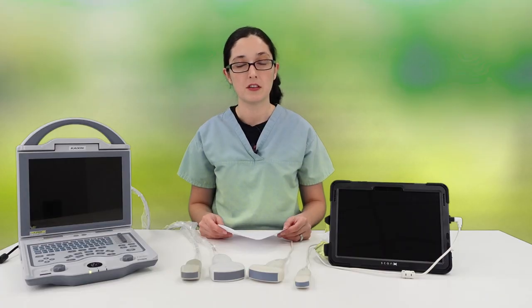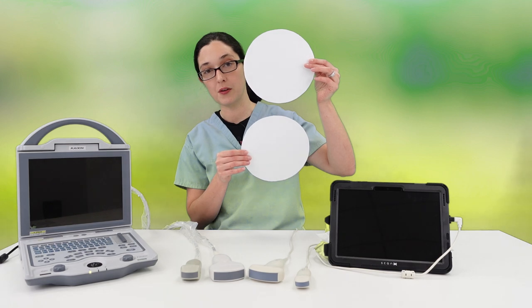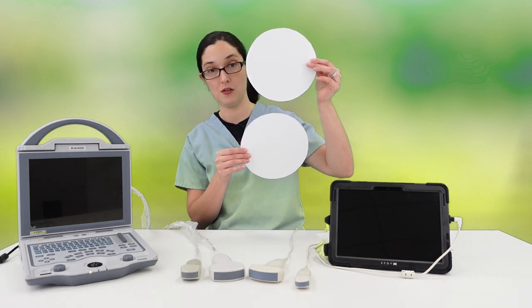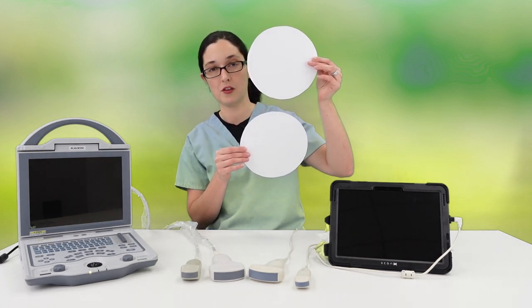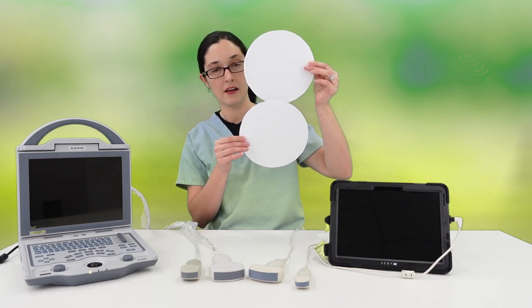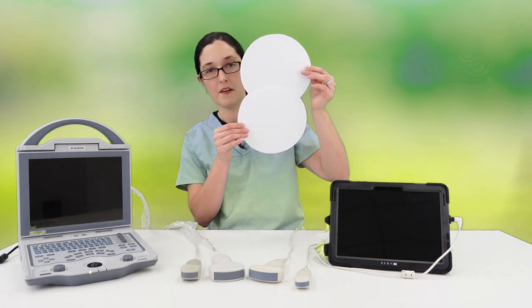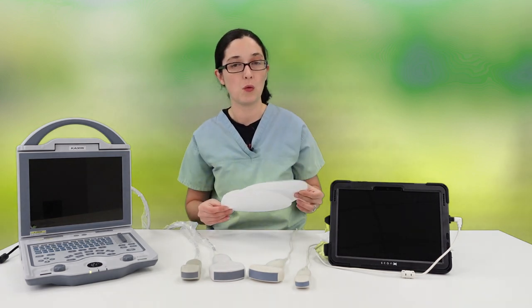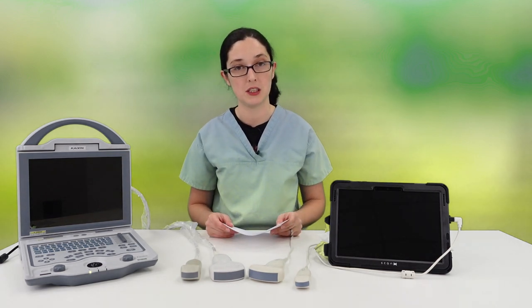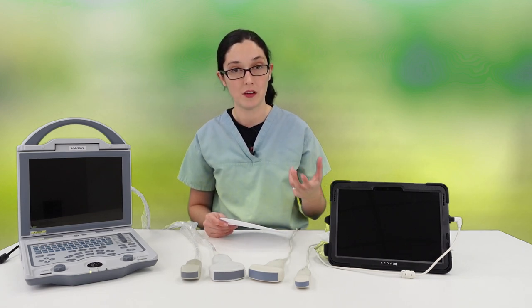Higher frequency ultrasound gives higher resolution images. What that means is that if you have two distinct points, using high frequency you're more likely to see those as two different points on your ultrasound monitor. Using low frequencies, they will just be one fuzzy blur on your screen and merge into one. You won't see them as two individual points — that is what is meant by image resolution and why higher frequencies give sharper, clearer images with greater detail.